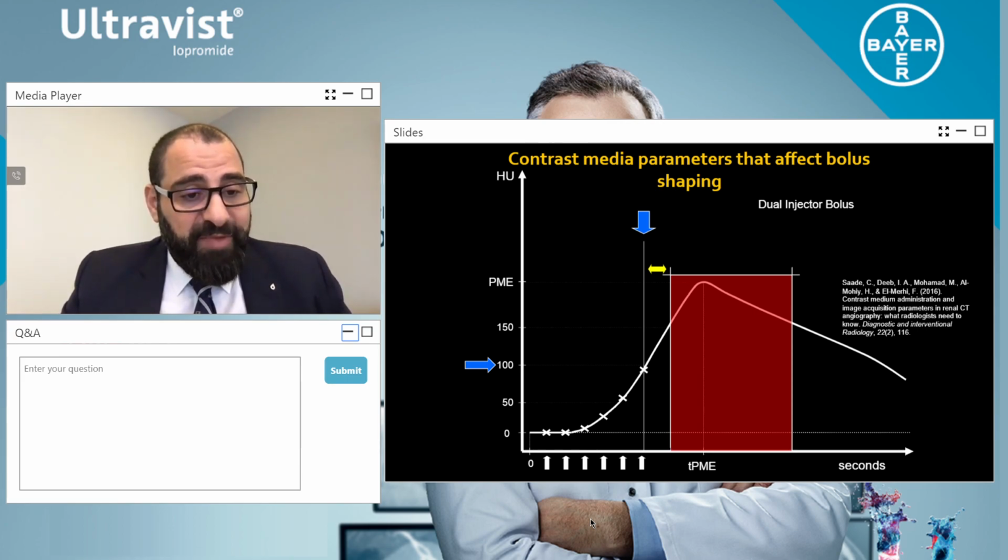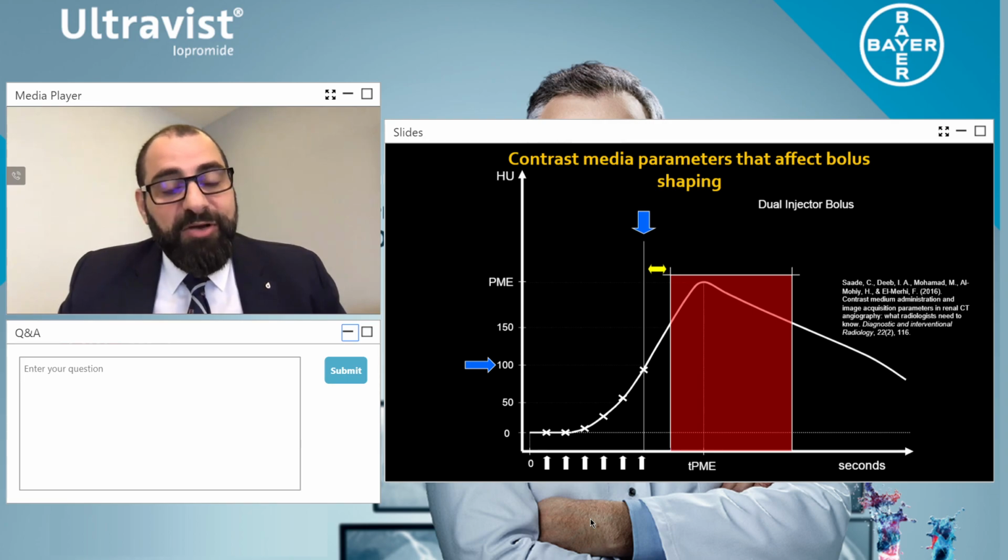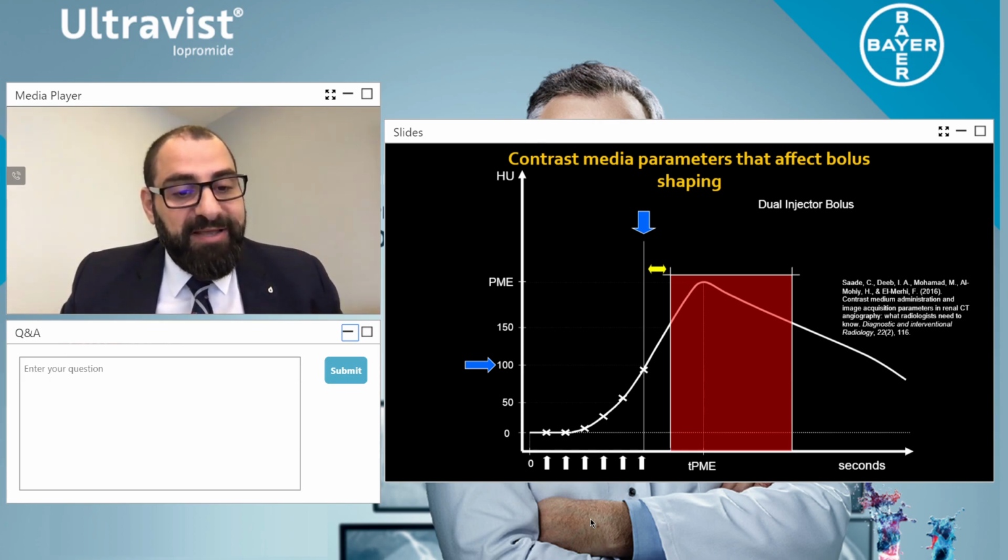We also have Mr. Kumar. For the puff cheek technique or Valsalva, how can we open the mouth? Well, Mr. Kumar, let me tell you, it's really important that we don't do the puff mouth technique because I showed you it stops the contrast coming in through the superior vena cava. And this is actually worse to do when you come to do it with CTPA, especially with pregnant patients, which is another problem. But we have a dedicated lecture for this in the coming series with Bayer.